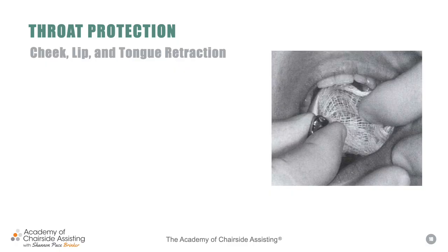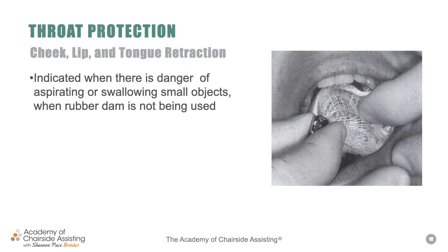And so one of the things we always want to make sure of is if your doctor is utilizing this type of procedure and utilizing 2x2s, which is a gauze, you always want to wrap some floss around it and ligate it and tie it in a knot. So this way, if the patient does swallow it, you can grab it quickly and pull it out. I personally don't like this technique because there have been patients who have passed away, unfortunately. So again, I feel it's a danger and I don't like to utilize it.